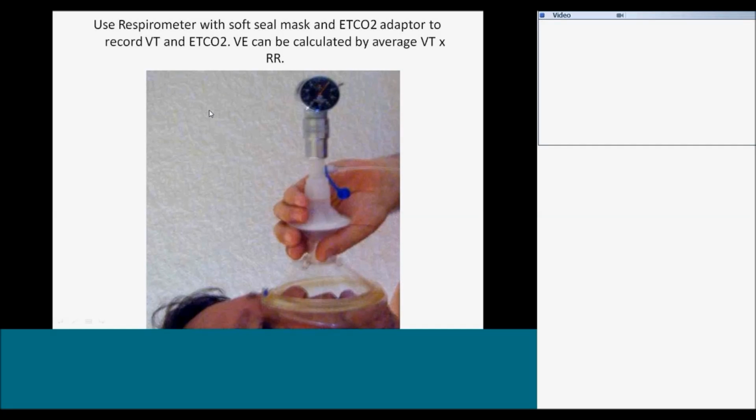You can get a cannula for the end-tidal CO2 monitor, and it will pull through an end-tidal CO2 monitoring cannula if you desire to do it that way. But it's harder to get a good seal on the mask and get your volume estimate if you're using the cannula. So it's six of one, half a dozen of the other. Some people do it one way, some another.